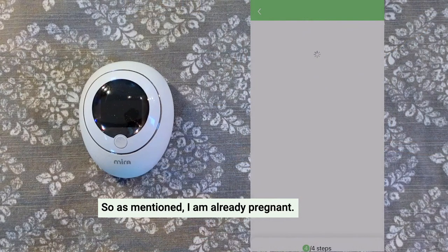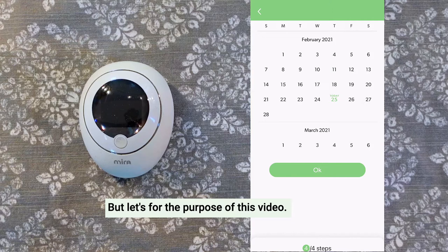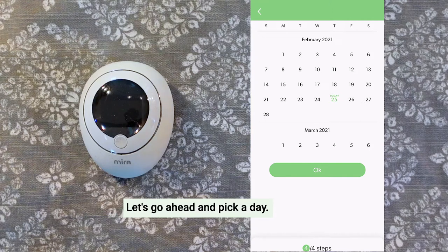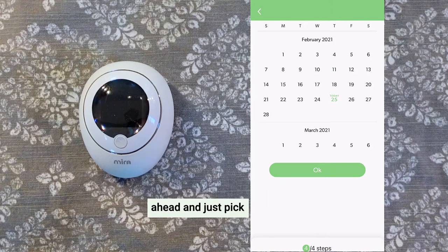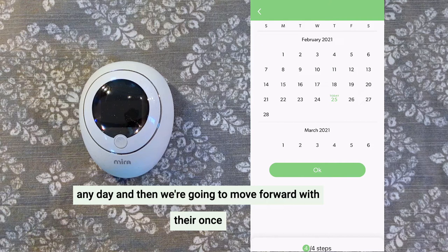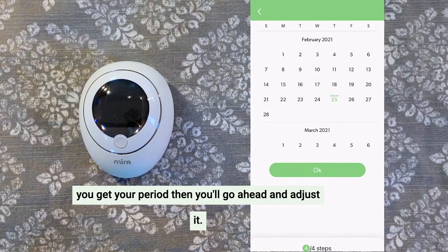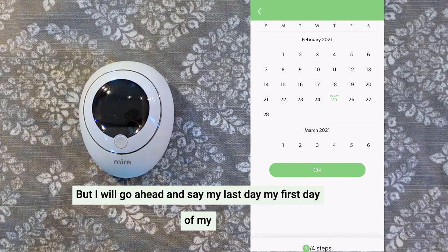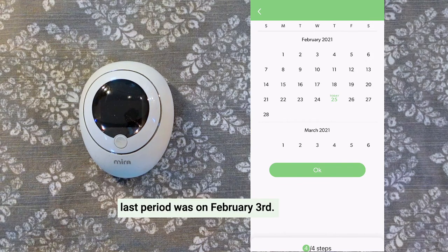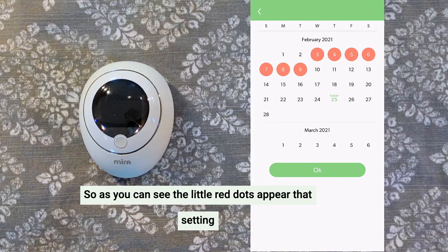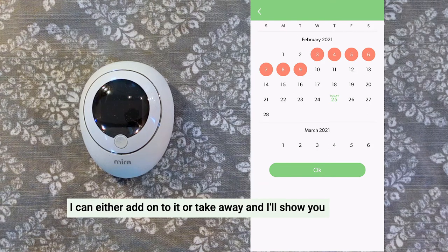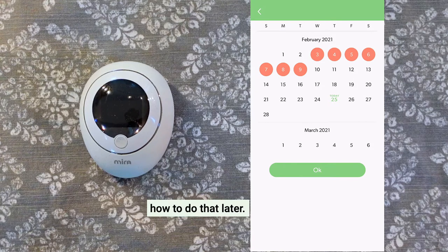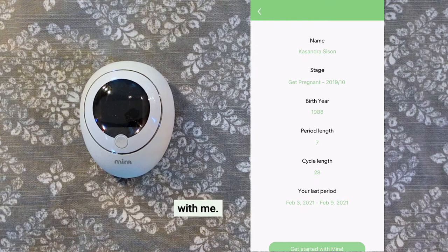As mentioned, I am already pregnant — but let's for the purpose of this video go ahead and pick a day. My cycles are pretty regular; I always had them at the second of every month. In the event your period has not come in a long time and it's not regular, go ahead and just pick any day, then move forward from there. Once you get your period, you'll go ahead and adjust it. I'll say my first day of my last period was on February 3rd. As you can see, the little red dots are Mira predicting the length of my period. I can either add on to it or take away, and I'll show you how to do that later. Let's get started with Mira.